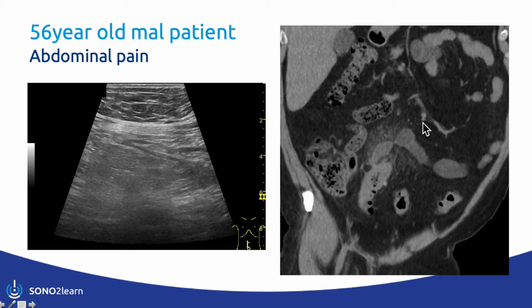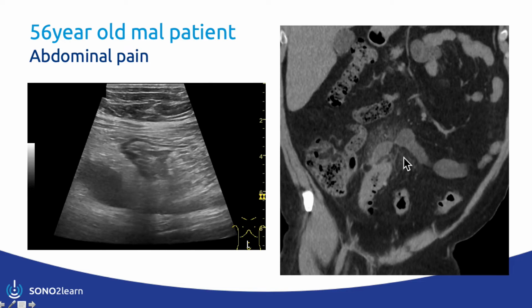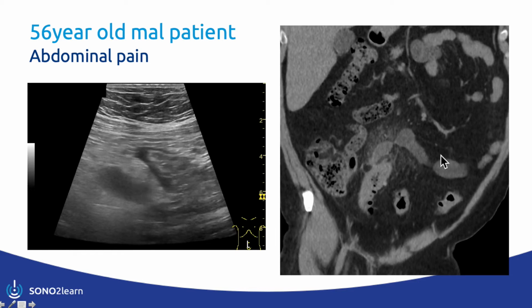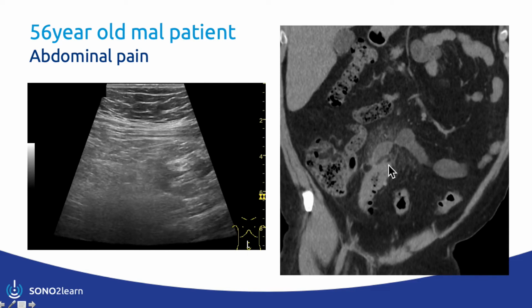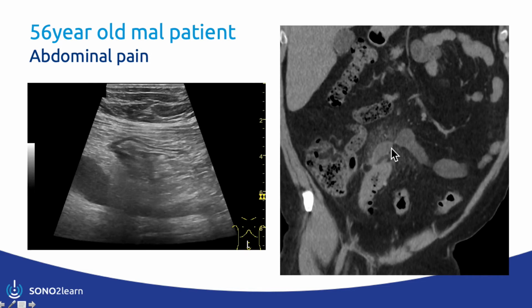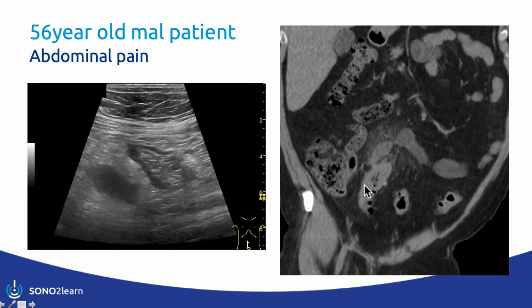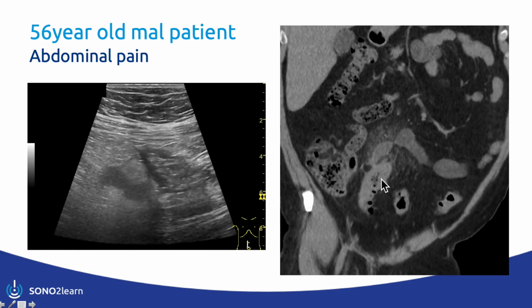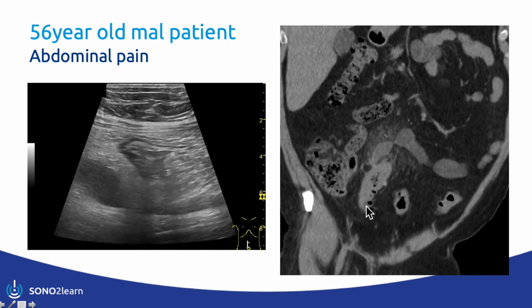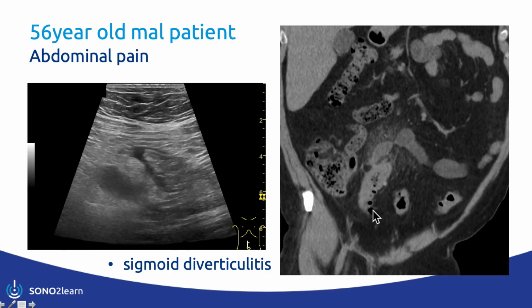We have a section of the sigmoid and a pronounced reticular reaction. This is what normal fat looks like. Normal fat. Here we have inflammatory imbibed fatty tissue. And in this inflammatory imbibed fatty tissue, the fluid content. Here it continues with the wall-thickened sigmoid. You can also see how the sigmoid makes a large loop from the left lower abdomen into the right. Only then does it descend again deep into the small pelvis. With that, hopefully, your preliminary diagnosis of sigmoid diverticulitis with perforation or abscess is confirmed.